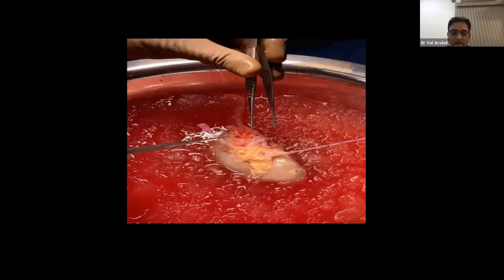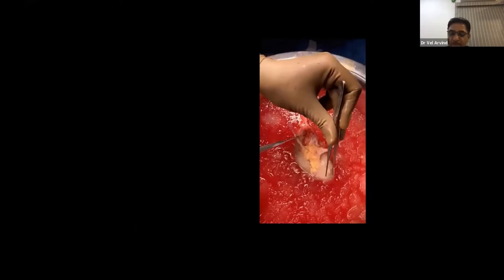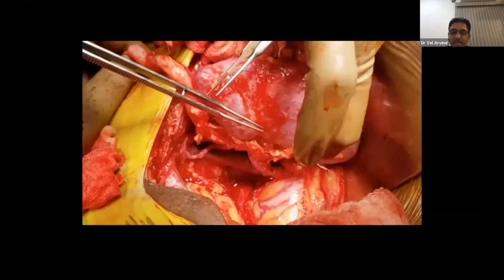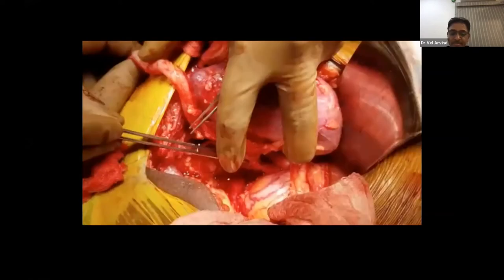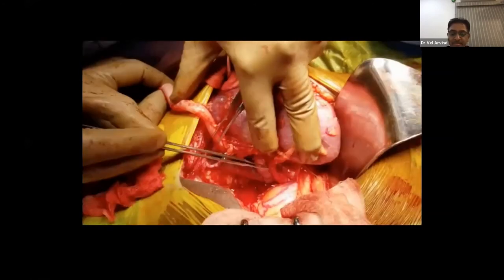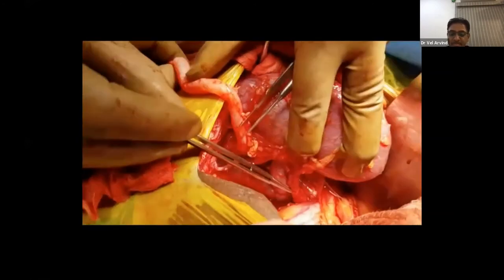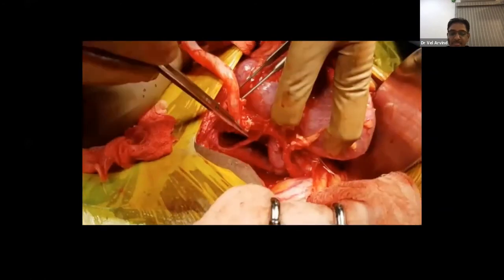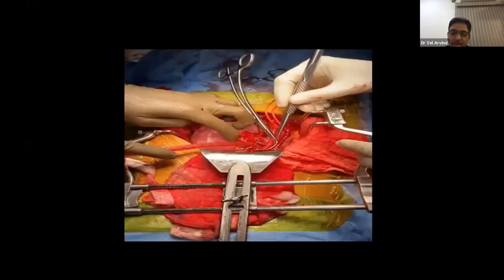So this is the one I want to point out. Before transplant, with double vessel or triple vessel, the surgeons make some kind of a short note about it. This is the one main, one or two, three. So this kind of thing is very important. Here is a well perfused graft, graft vein to external iliac vein, graft artery with two branches. Can you see the branching here? This is one branch, and this is one branch, an early branching to the internal iliac. You can see the accessory renal to the inferior epigastric. So for an inferior epigastric anastomosis, whenever you do a renal Doppler, you have to see the flow. It is actually very difficult to visualize.